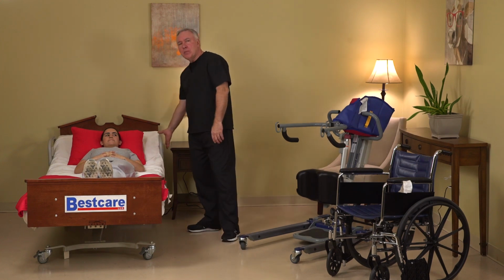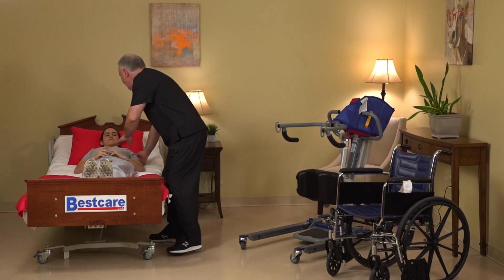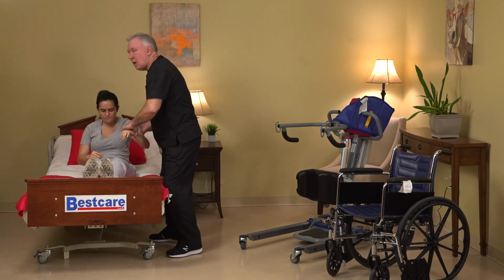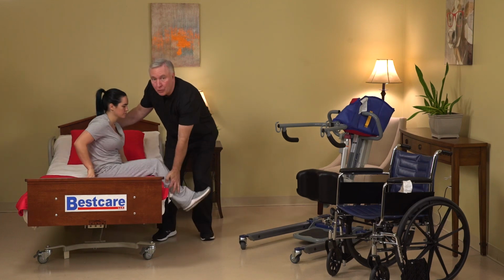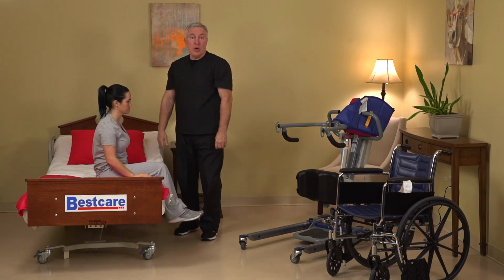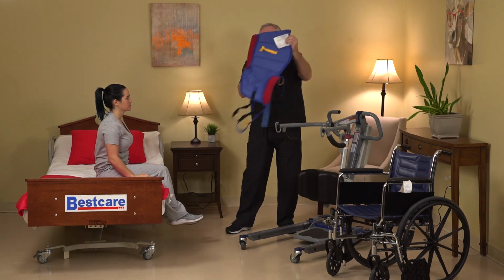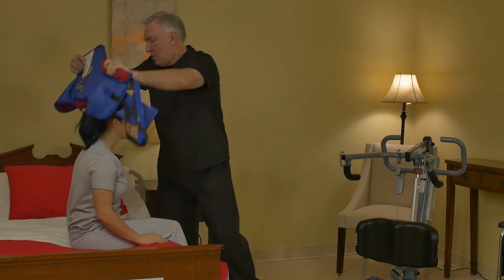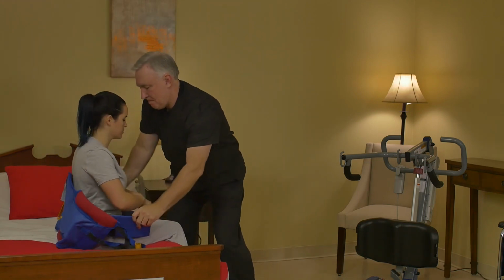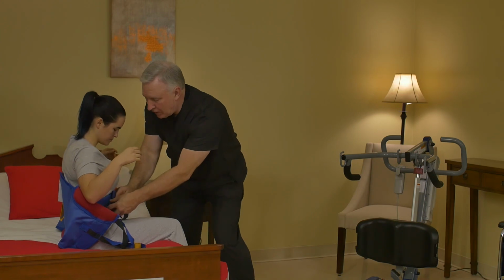So we can either use the bed to sit the patient up, or we can just simply assist the patient into the upright position. And then we need to pivot the patient around so their feet are over the bed and they're in a seated position. So at this point, we would grab the support sling, put it behind the patient's back, buckle it up just like we normally do.